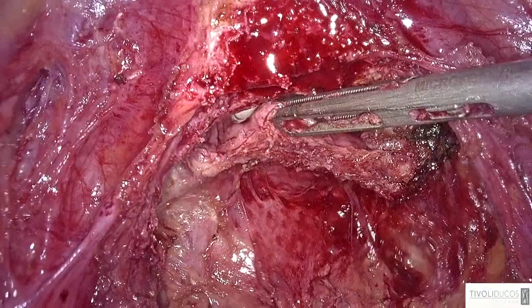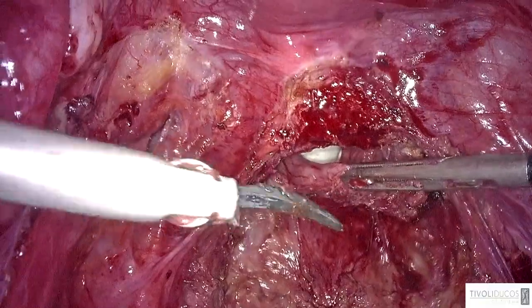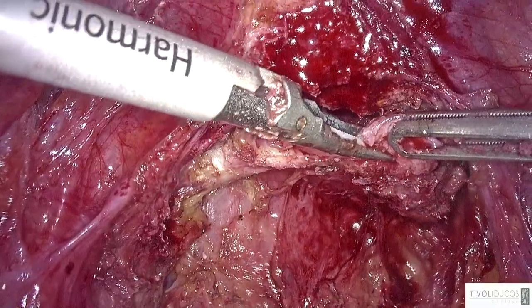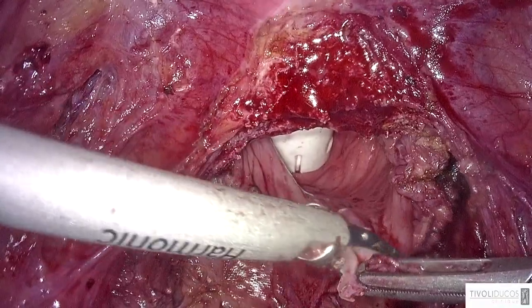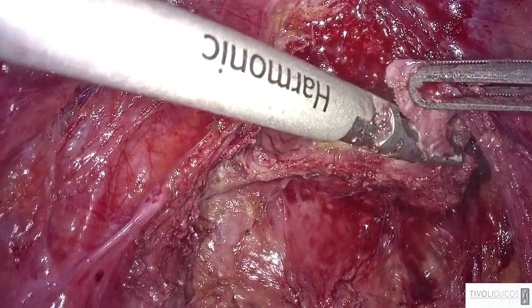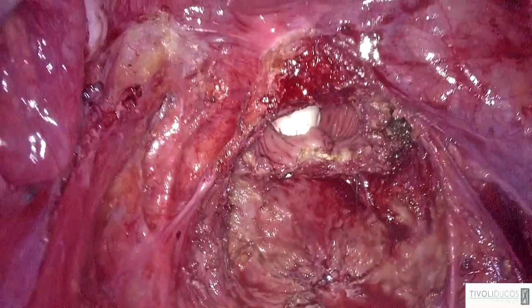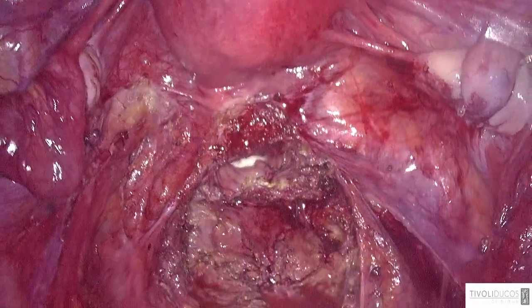Hold it. Horace, why don't you use intracorporeal continuous closure of the vagina? You are always using separate extracorporeal stitches. Because I think that if one of the stitches fails, all the running suture may open. But I have no arguments to say that it is better like this because I told you I have enough fistulas not to believe that I'm doing better than other colleagues.